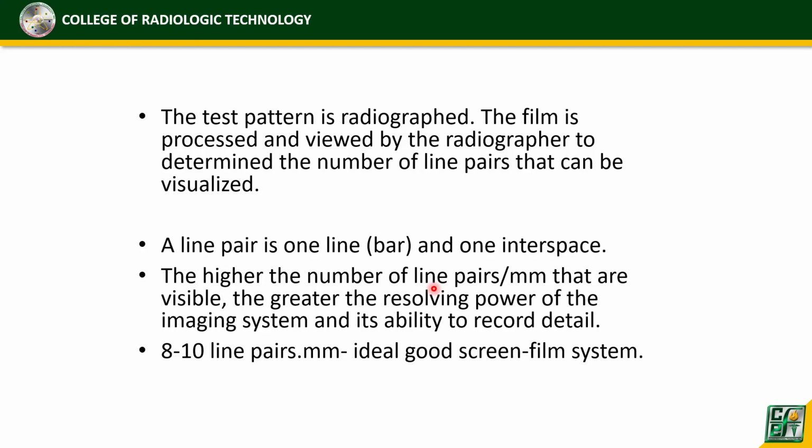So yung test pattern, ine-x-ray siya, okay? Then, of course, pagkatapos mo x-ray, de-develop mo, tapos titignan ng radiographer or ng QA/QC officer yung radiograph to determine the number of line pairs that can be visualized. So one line pair is one line bar and one interspace. Okay. So the higher the number of line pairs per millimeter that are visible, the greater the resolving power of the imaging system and its ability to record detail.